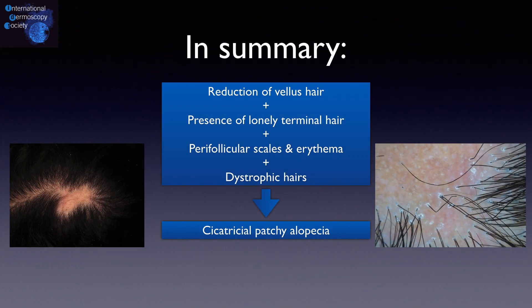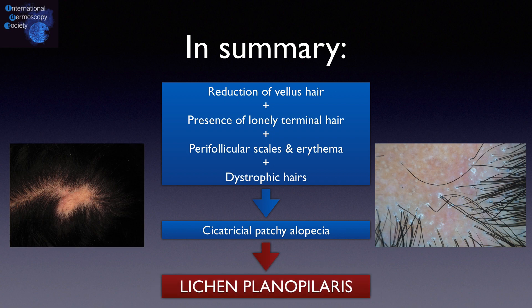In summary, a patch alopecia with decreased vellus hairs, presence of a lonely hair in the center, intense perifollicular scales and erythema with many dystrophic hairs on otherwise normal scalp skin is suggestive of lichen planopilaris.